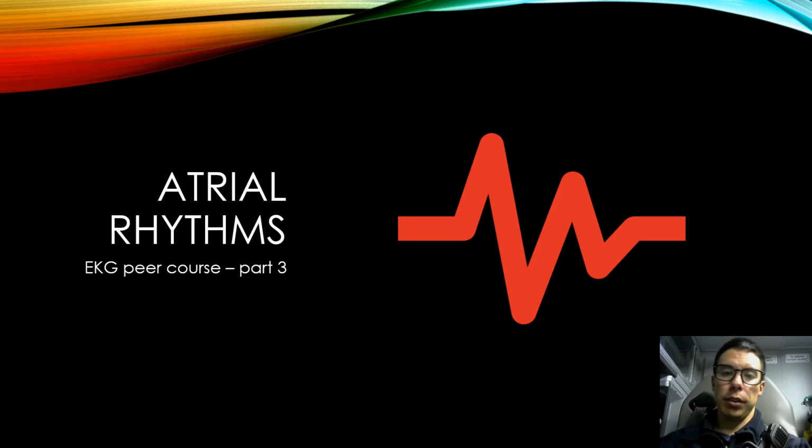We also aren't going to go over any of the review stuff of electrophysiology or a little bit of physiology and anatomy, but just as it pertains to each individual rhythm. So that'll save some time too on these videos, so hopefully they start going a little bit quicker. But with all that, let's jump into atrial rhythms.